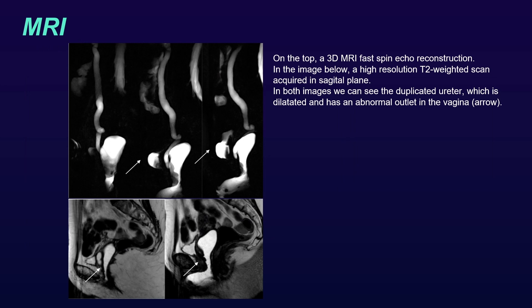On the MRI, we can see in both images the duplicated ureter, which is dilated and has an abnormal outlet in the vagina, marked with arrows. On the top, a 3D MRI fast FIESTA reconstruction. On the images below, a high-resolution T2-weighted scan acquired in the sagittal plane.